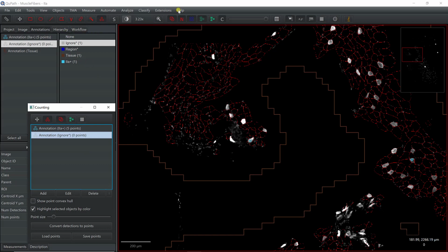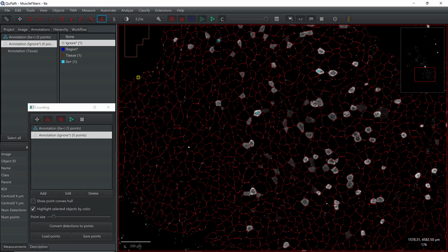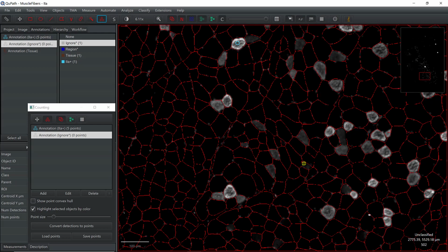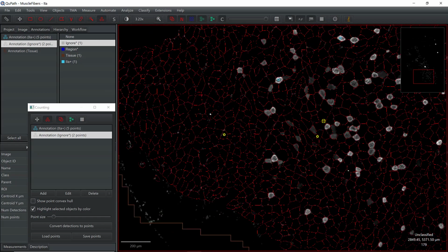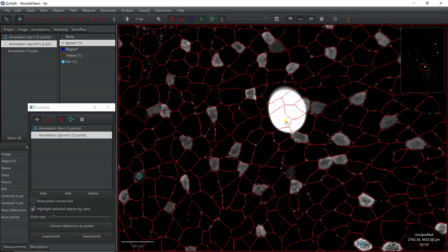Then same thing for negatives. When I hit there, I can hit the M button to actually move. I'm going to go back to this one. I'm going to say, okay, so this is negative. This is good because here we have some dots, just to show some example where it's not totally black. Something we can also try is to define this one as negative, even though it's super bright. So we'll see if it's able to differentiate these ones from the other ones.